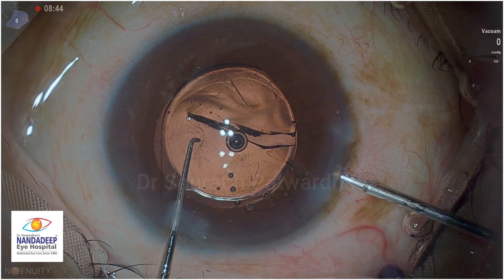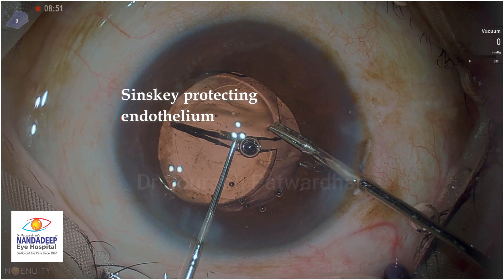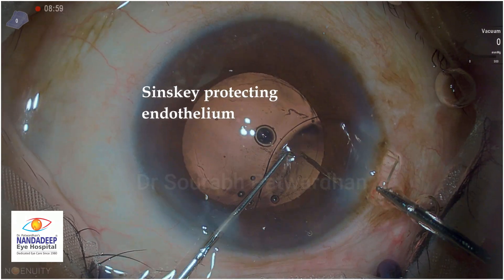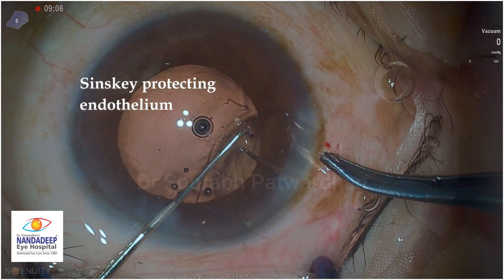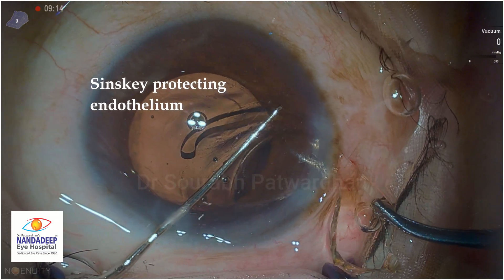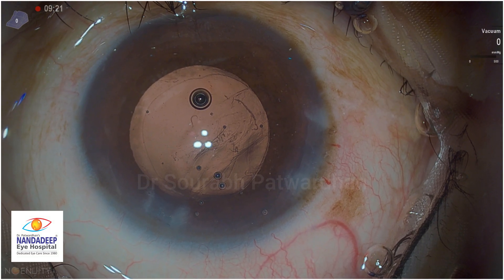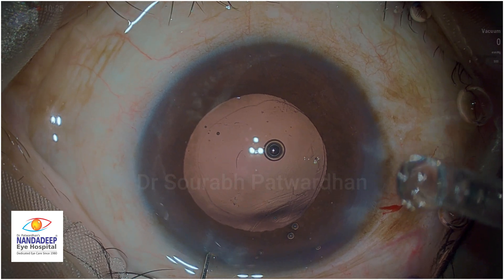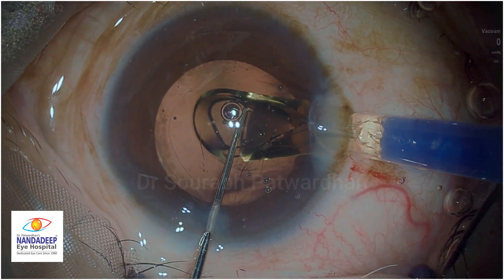Once that is done, I replenish the dispersive OVD. It is important that we hold the right side of the cut optic so that the haptic is easy to come out from the wound. I pulled it out with micro forceps, and you can see my left hand Sinski is always protecting the endothelium. I use limbs to pull out one part of the optic and then just rotate the IOL so the second part also goes inside the incision. Watch the Sinski protecting the endothelium - that is the most important thing when you remove the IOL. When you see the case postoperatively, you will not find any signs of IOL removal whatsoever. The cornea will be shining with no endothelial damage, and you can easily then place the replacement IOL.